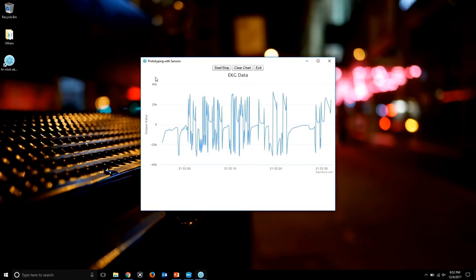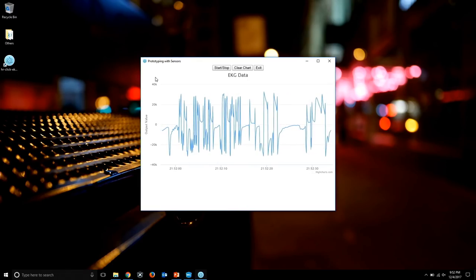Could I do my forehead? Yeah, you can probably do that too. It looks at the reflection of our blood, so you should be able to do that too. This is actually a better view for the people watching. Yep, we're getting good data too. Yeah, you are. Oh, that's cool. I see it. Cool.